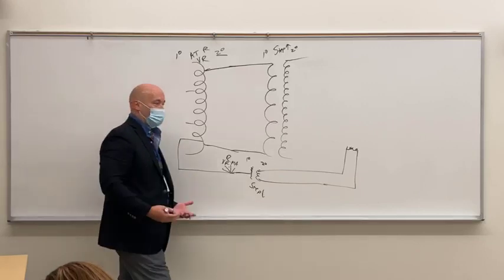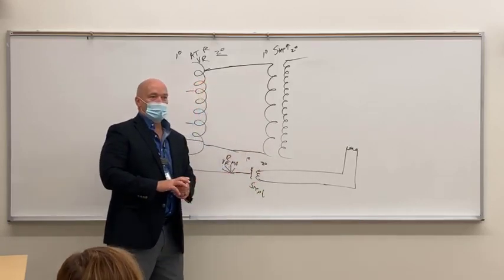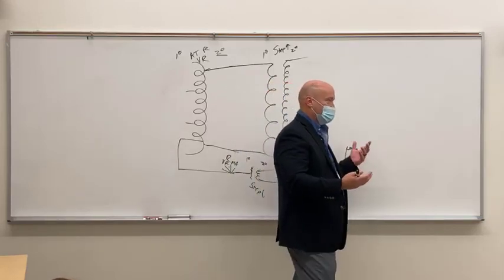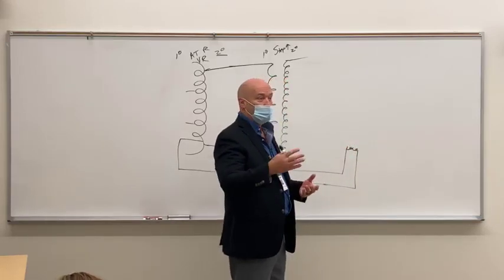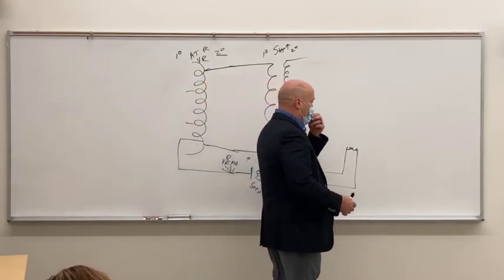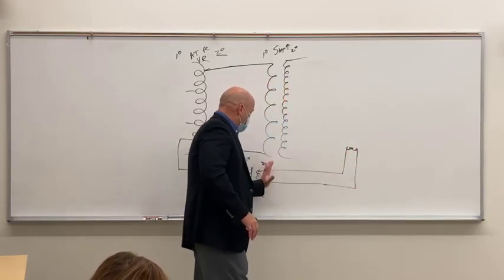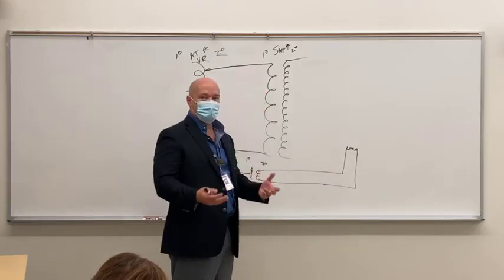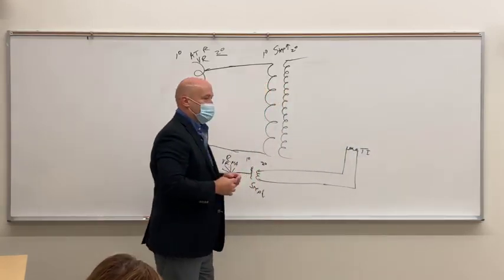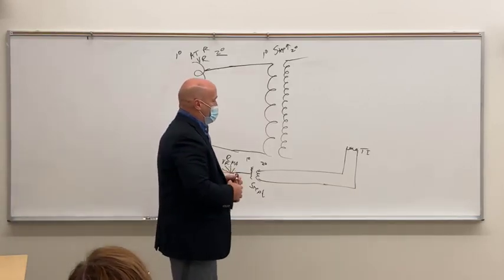What happens when we send electrons through a circuit? What do we create? Two things. Thermionic emissions, exactly. Somebody may say, well, you get a magnetic field, which is true, but that's not what we're interested in here. We do get a magnetic field because we send electrons through the circuit. But what we're interested in doing is heating up the filament. That's the only thing that we're really interested in. So we get thermionic emissions, right? When does that occur? Whenever you press the prep button, right?